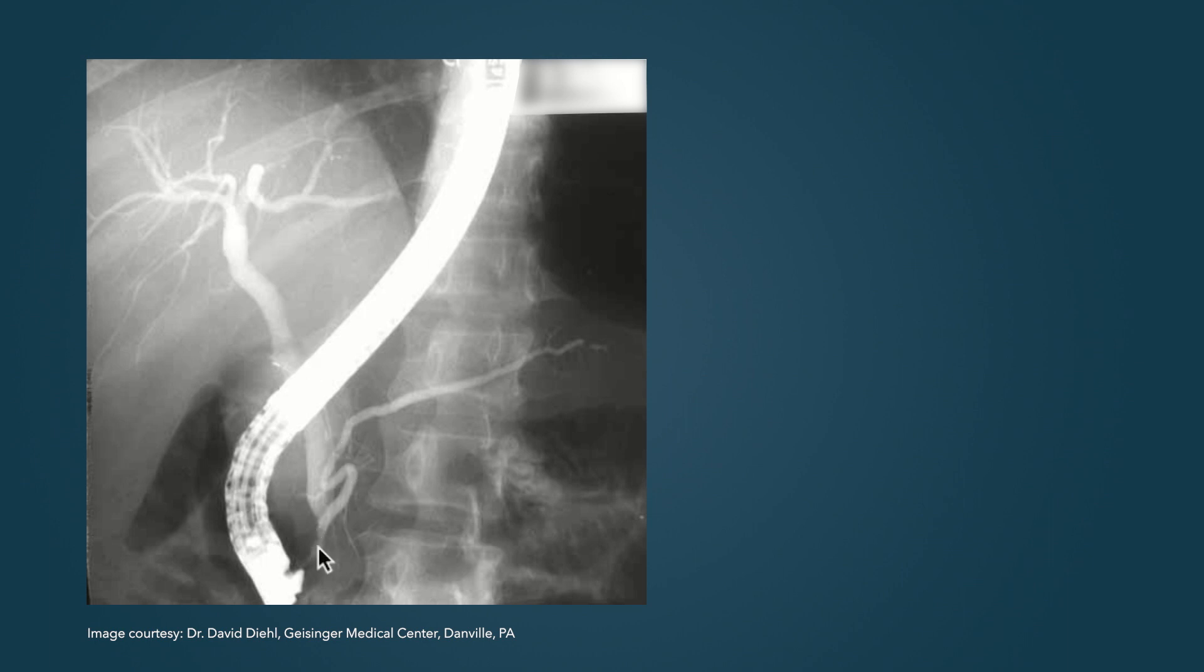The pancreatic duct has a more tortuous anatomy, but this is a very typical appearance. This area of the pancreatic duct is called the genu, which is a Latin term for knee. And this main pancreatic duct can be followed all the way out to the tail.